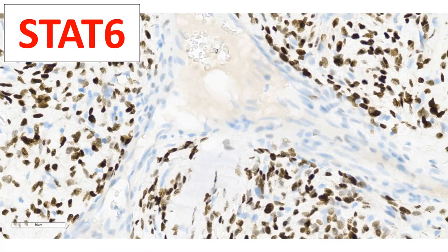And what we're looking for is aberrant nuclear translocation of STAT6, or an aberrant nuclear expression of STAT6. It should be only in the cytoplasm. It's in the nuclei. That confirms the diagnosis. And you see the blood vessel, this branching blood vessel in the center, all the endothelial cells serve as a negative control. So that's what you need to do. Let's say that all the nuclei are brown. You need to find an area with negative endothelia to make sure everything's not just non-specifically staining. This is something that pathologists know, right? You always have to have controls, that sort of thing.